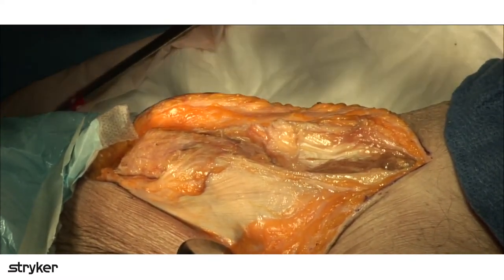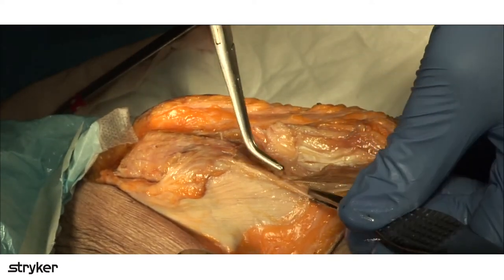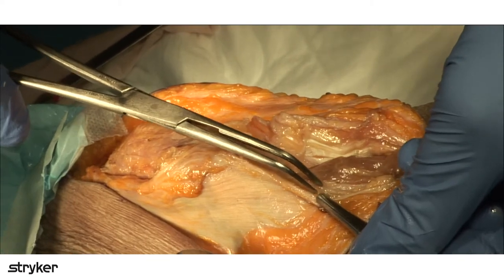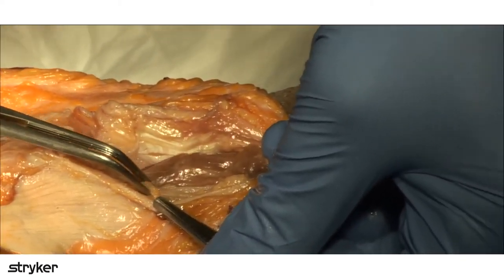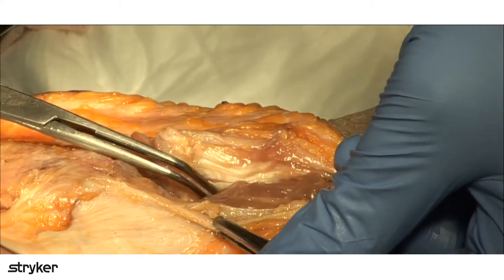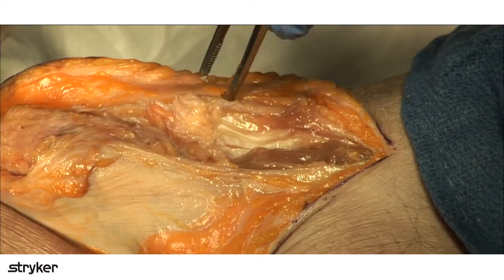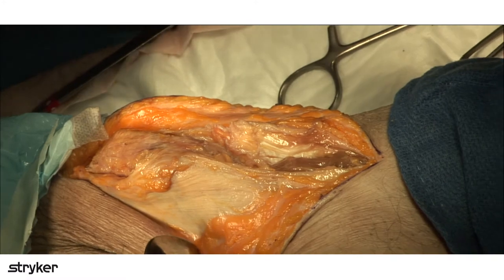You can see we exposed at least one small branch of that right here, still contained in your sartorius with the ASIS osteotomy. So it protects that nerve to some extent.